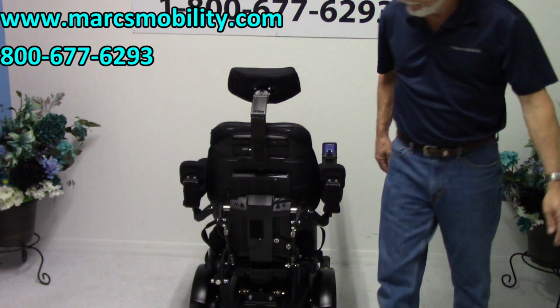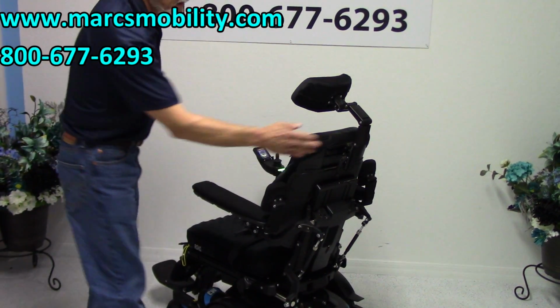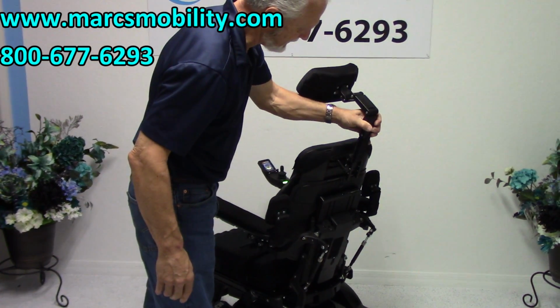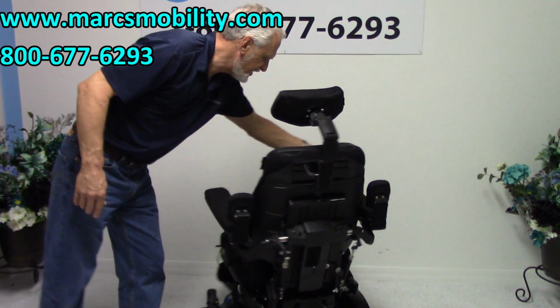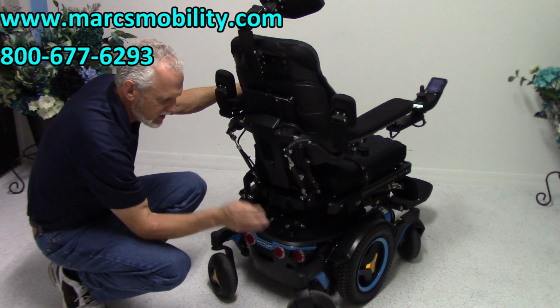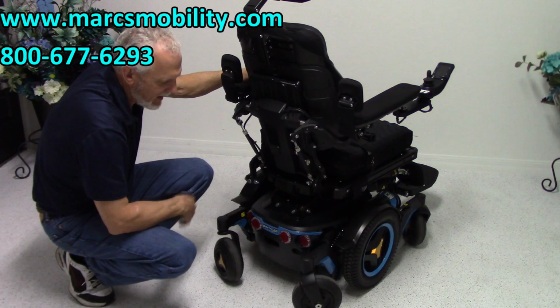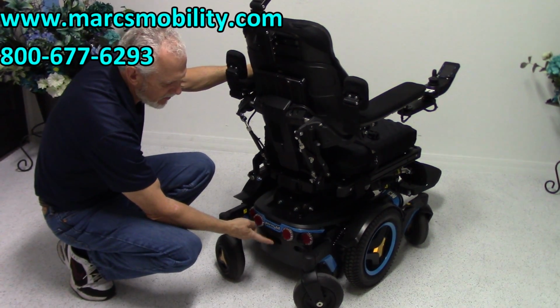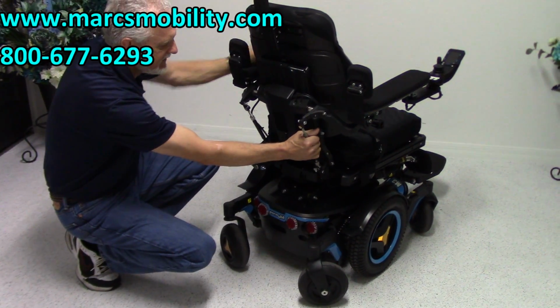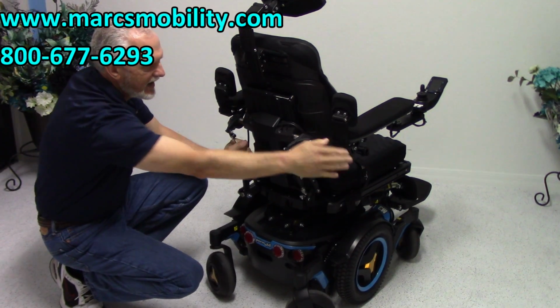In the back of the chair, we've got the headrest, a fully adjustable headrest. You can adjust the headrest right on the opposite side actually. And it can also be removed if you don't want the headrest. Back behind the chair right here, we've got a power button right where my finger is at. So when you receive your power chair, the power right here will be turned off. I just turned the power off now. I've just turned the power back on, okay? So look over here, turn your power on over here. These are only reflectors. These are not lights on this chair, okay? These cylinders right here, there's one to the right, one to the left. If I turn this cylinder, it tips the arm up or down over here, okay?